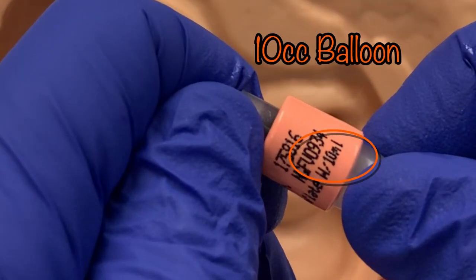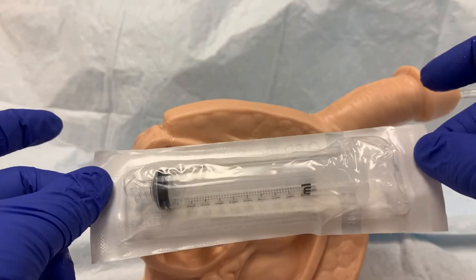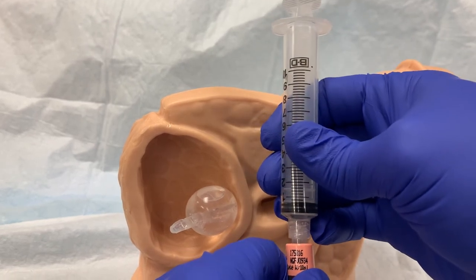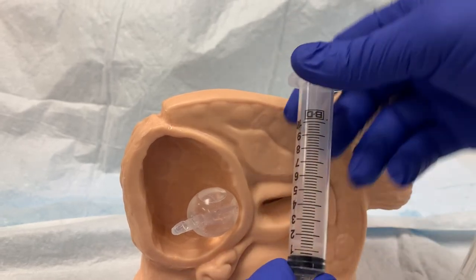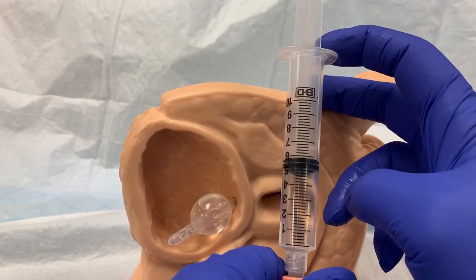The standard Foley catheters in the unit pod rooms have a 10cc balloon, but larger or smaller catheters used in specific situations may have larger or smaller balloons. It is important that all water be emptied from the balloon prior to removal, or damage to the urinary tract will occur. Having verified that this is a 10cc balloon, take a standard 10cc syringe. This port is not the regular screw-in style, so just push the syringe onto the port. Water may start to fill the syringe as soon as the port is accessed, but likely the seal will need to be broken first. Gently pull back on the plunger until you feel it pop and loosen its grip, then let go — the pressure from the balloon will push the water out and into the syringe without any need to pull back on the plunger.